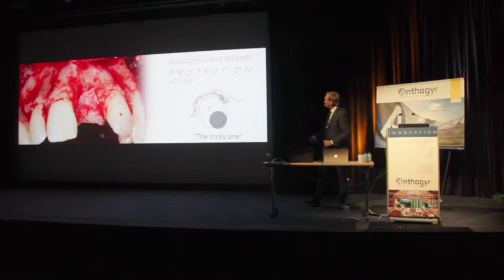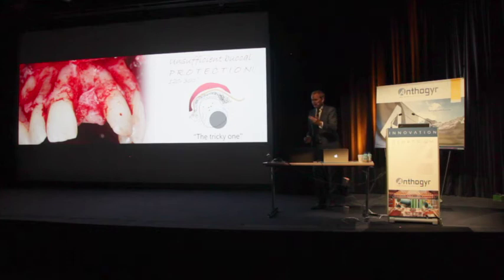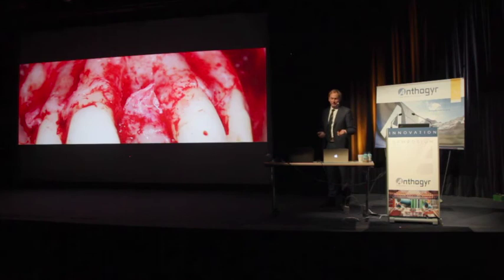And this is why we graft also on the outside if we have a situation like this. Or do first the extraction, wait 5 weeks, and place the implant later. Early implant placement may be better in these cases, because then what is gone is gone, and you can regenerate what is missing, like I had to do after 4 years. So the implant was gone, healing was complete.